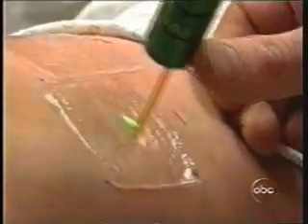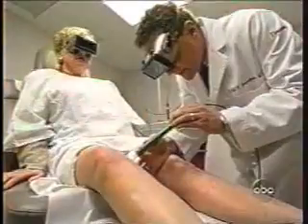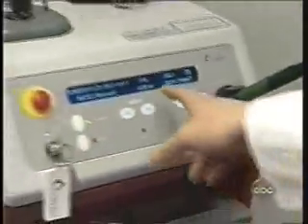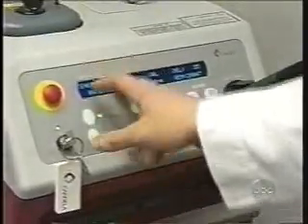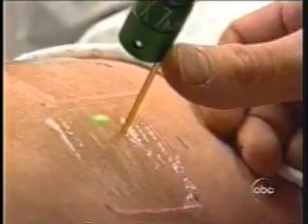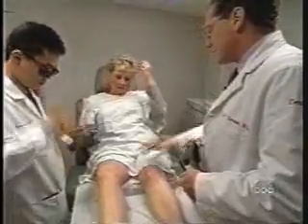Dr. Eric Bernstein, a dermatologist at Philadelphia's Thomas Jefferson University, has led a study of another high-tech tool for the treatment of spider veins. ScleroLaser went on the market in February. Dr. Bernstein says the ScleroLaser is not a light source, but a true laser. We use a specific wavelength of light that's absorbed by the blood vessel, so the surrounding tissue is not really affected. Thus, you don't get a scar.